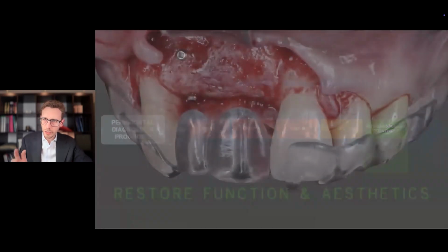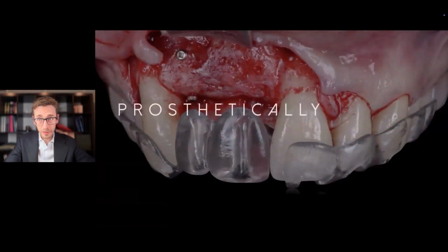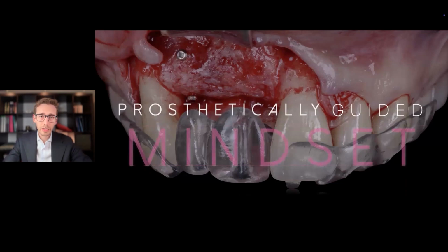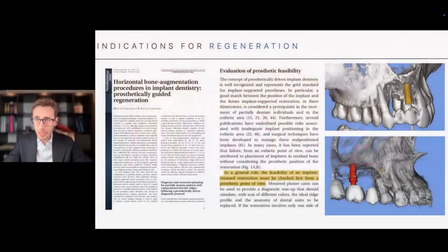And of course, the second that we move from a therapeutic intervention to a rehabilitative intervention, we have to acquire a prosthetically guided mindset, which means that every time that we are rehabilitating a patient with a treatment sequence that is going to end with a prosthetic device, the objective should be the prosthetic rehabilitation.